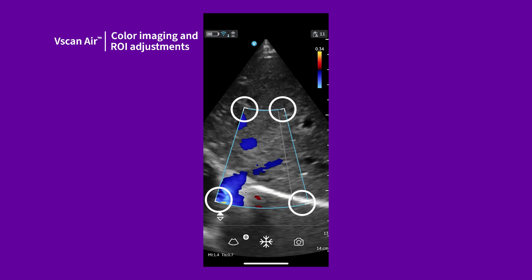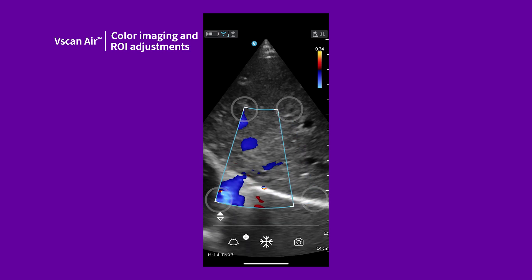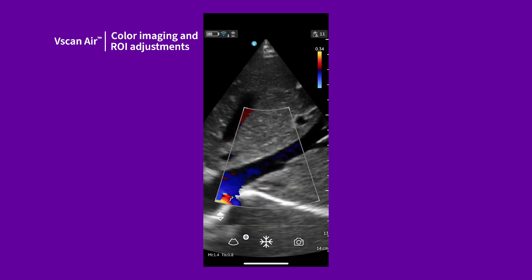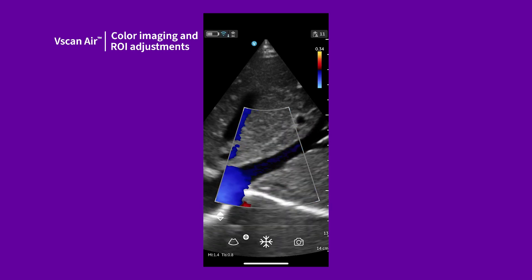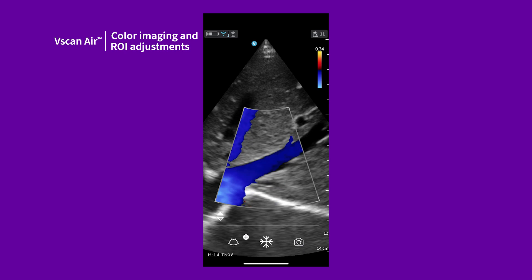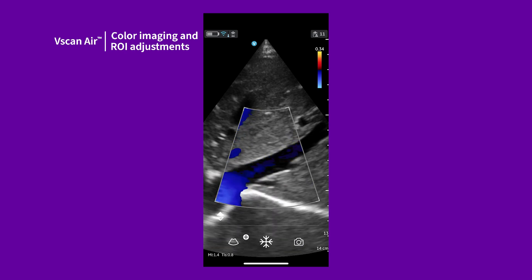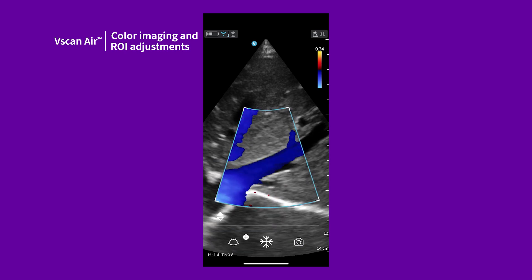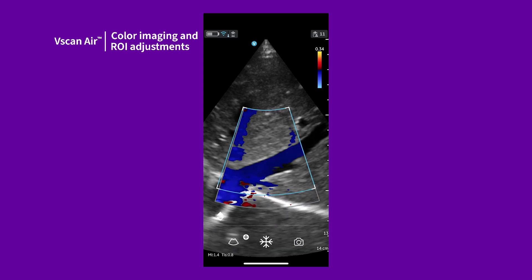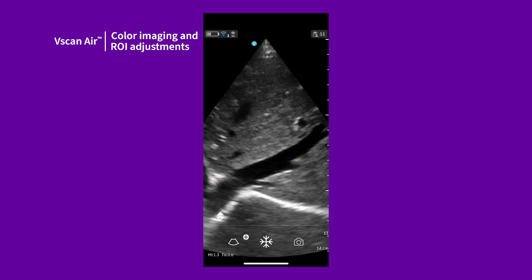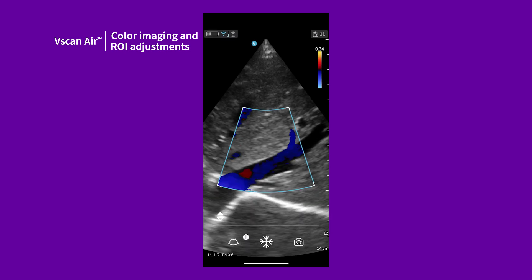Drag the corners to adjust the size. The size of the ROI has a significant effect on the frame rates and sensitivity, width more than the height. Keep the box size just to fit the anatomy of interest.